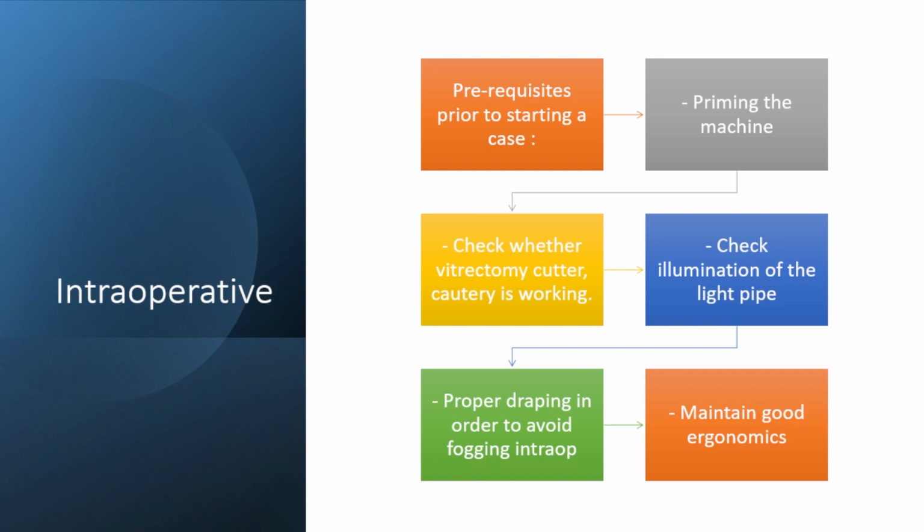So like that, very often the lens tends to adapt to the existing humidity and temperature, and it doesn't fog as easily as it was doing initially. But still it can get fogged when you go too close to the cornea because the humidity is highest there, not a little away from the cornea. So you can keep on going back and forth and doing your surgery rather than worrying about the fogging. But yes, if it's still a problem, you try to do something like, even in the worst cases, I even removed the entire drape and stuck again the Tegaderm to make sure it's not fogging. All right, can we go back to the next slide?